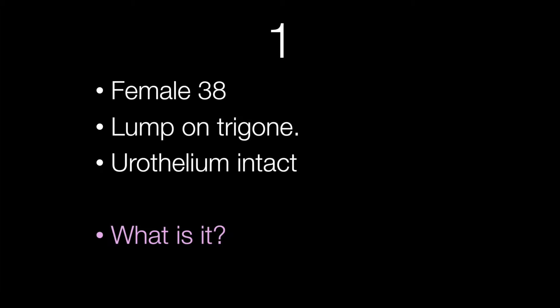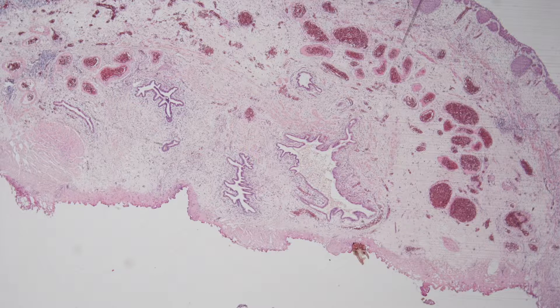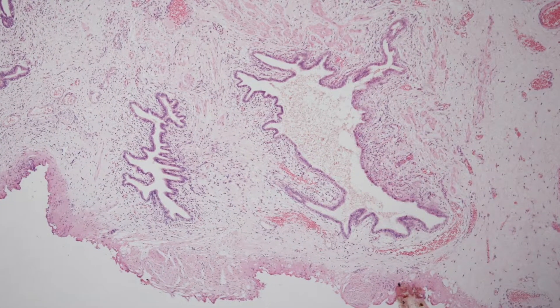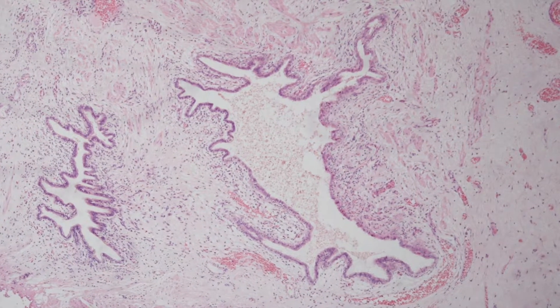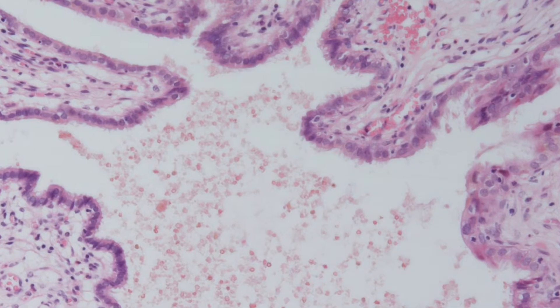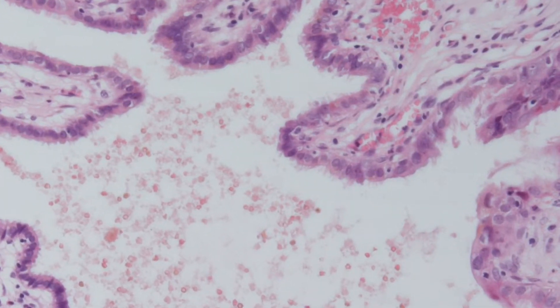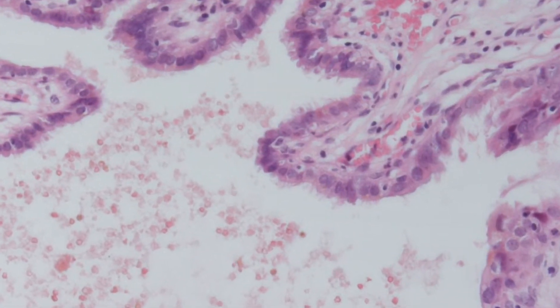The first case is a female of 38 with a lump on the trigone. The overlying urothelium is intact. What is the lesion? This is a low power view. Here's a higher power view. As we zoom in even further, have a look at the epithelial cells. What type are they?